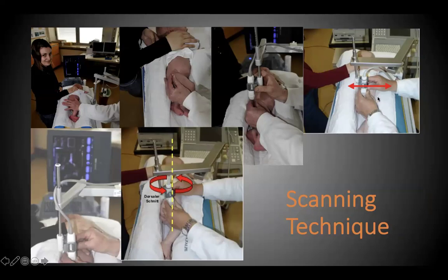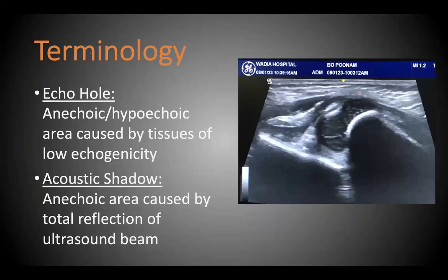And then you start moving the probe from front to back to see the entire anatomy of the hip joint. And then you're supposed to stop when you see the lower limb. And then, depending on the plane you are in, whether you're anterior or posterior, you would rotate the probe to get the standard plane.